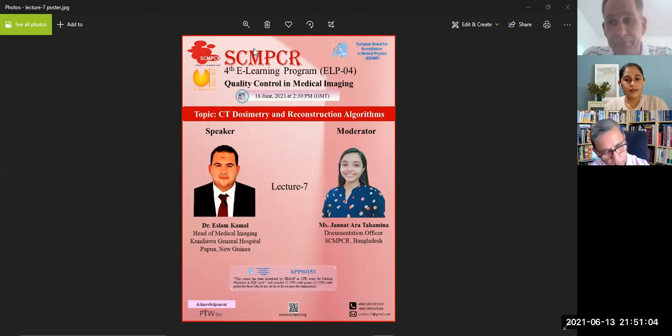the cine time. I know that it is related to the regulations from the authorities, whether they have to show it or not. I know that in the EU they have to show the exposure time, so the cine time and the fluoroscopy time. That's something they have to show. The funny part is they're showing the time they have measured. It's maybe not the real online time.